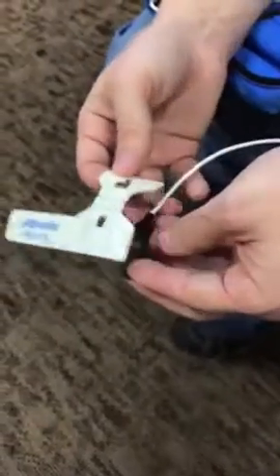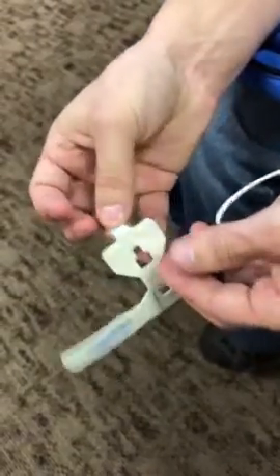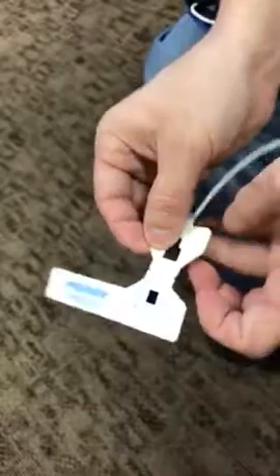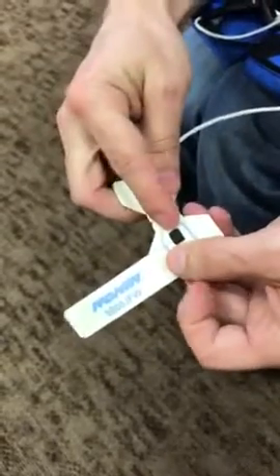Okay, so match it up, peel it off first. Then match up the square and square and a little long part — so square, square, and a little long part. Stick it over the top, and take the square part.